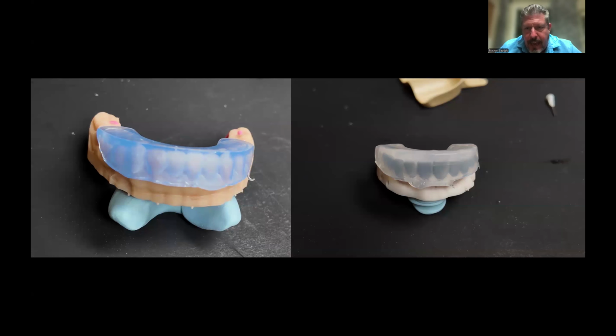Now you can see when it comes out, I have this beautiful, even, clear matrix. The one on this side, the blue one, is Seal. The other one is this Elite Glass. I like Elite Glass better than Seal.